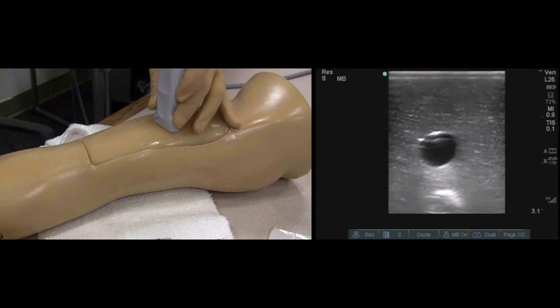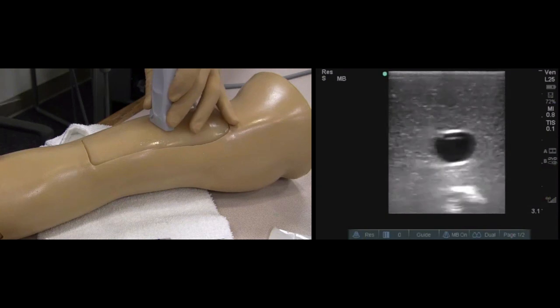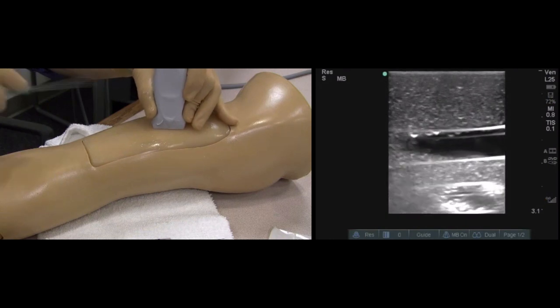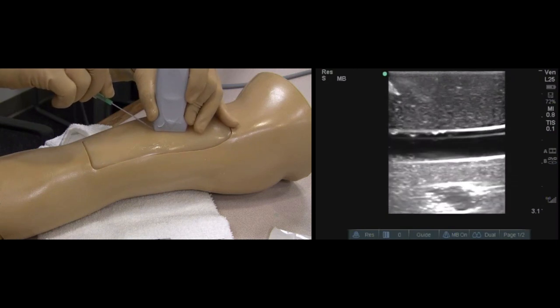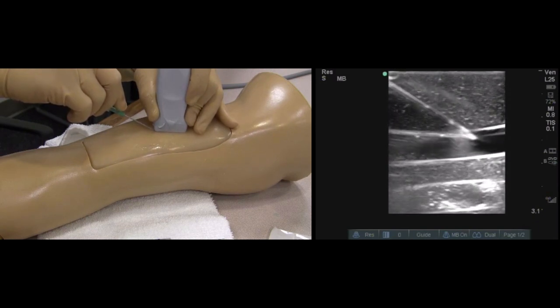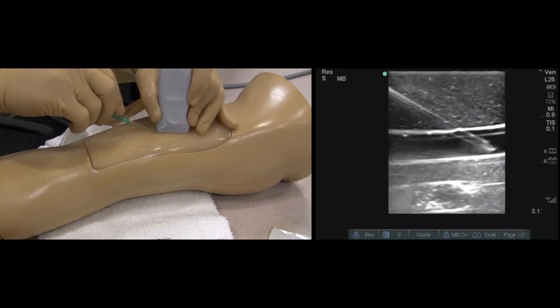Here on this phantom we're accessing a vessel in the upper arm that's a little further into the soft tissue. We've repositioned the arm for a flat surface, using a low grip on the probe with the hand braced. We rotate from the transverse to the sagittal view, using a longer catheter because the vessel is deeper. We have the sagittal view, line the needle up with the seam of the probe, advance the needle tip through the anterior wall into the vessel, confirm the tip is within the lumen without puncturing the posterior wall, then thread the catheter.